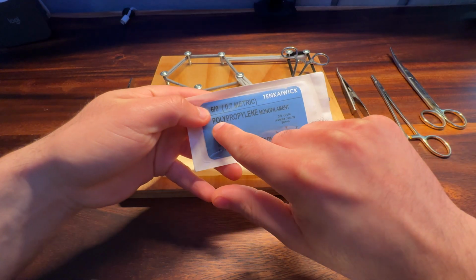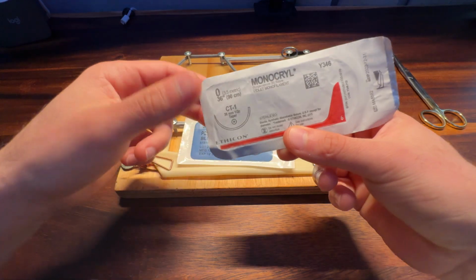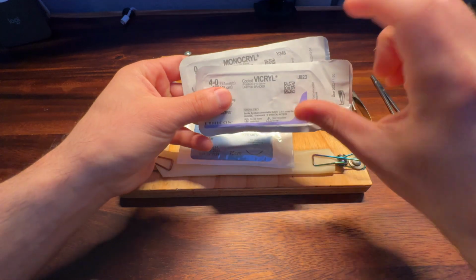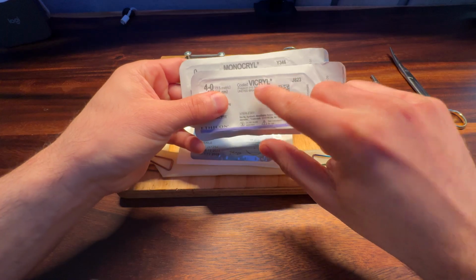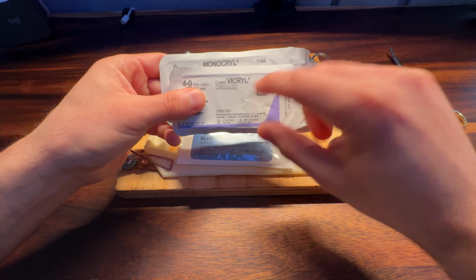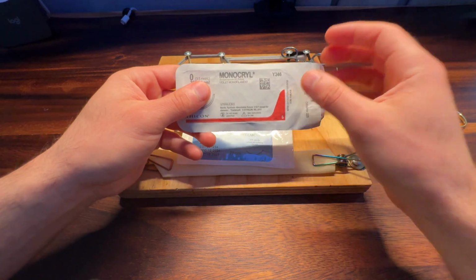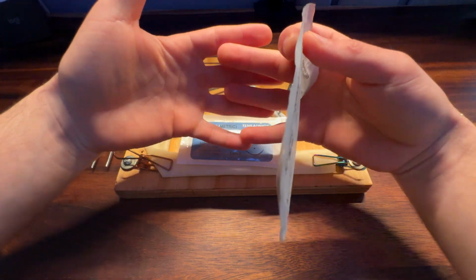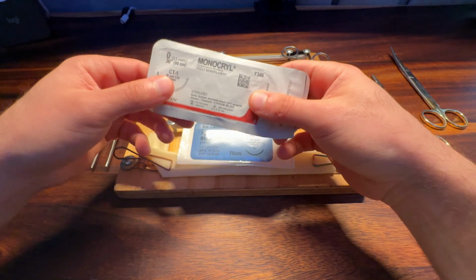Second of all, you want something that is not absorbable, okay? So I'm going to give you an example here. Here I have some Monocryl. Like I said in my other video, the crils are going to be absorbable, okay? So the Vicryl here is braided, so that means multifilament, a suture that's going to be absorbable in the body. And then you have the Monocryls. This is going to be used for dermis, so it's going to be absorbable, right? Because you just want time for the dermis to heal and come together.